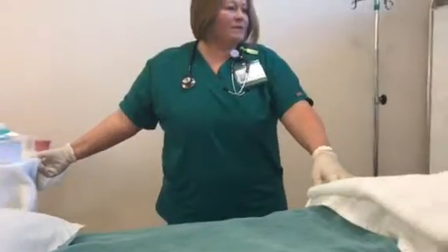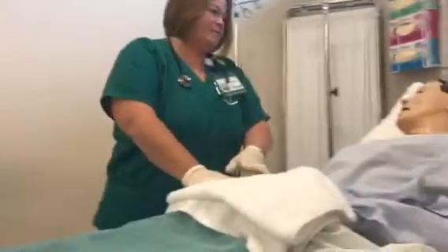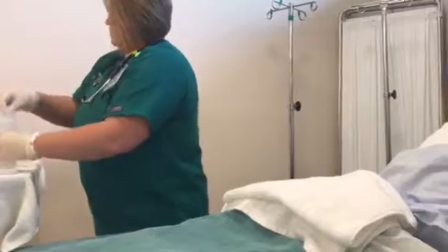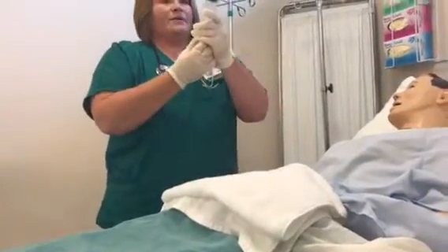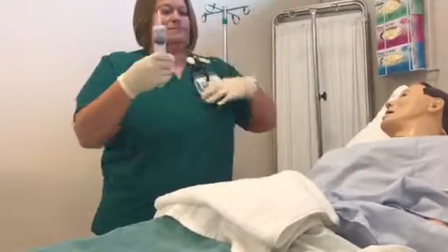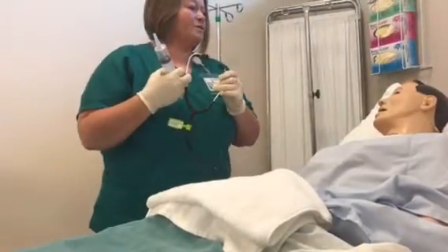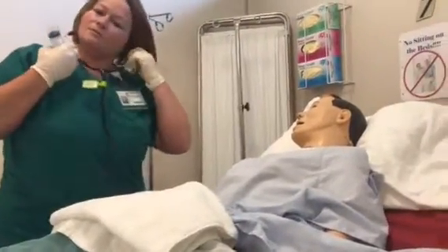So, Mr. Pearson, the first thing I need to do before we get started is I need to check for tube placement. Okay, so what I'm going to do is I'm going to get my syringe here. And I'm going to drop anywhere between 10 and 30 mLs of air. Good. I'm just going to be listening to your tummy here. I'm looking to hear a swoosh sound. If I hear a swoosh sound, that lets me know that the tube is in the correct place.